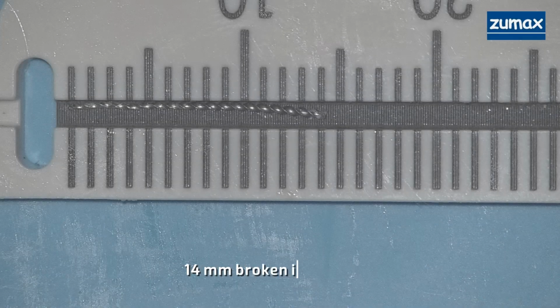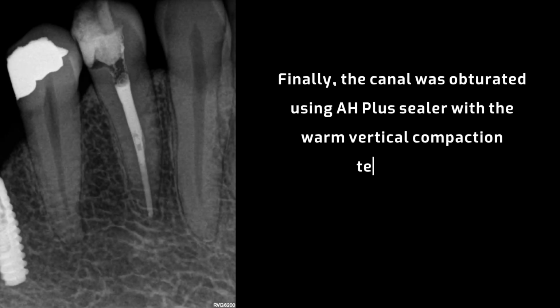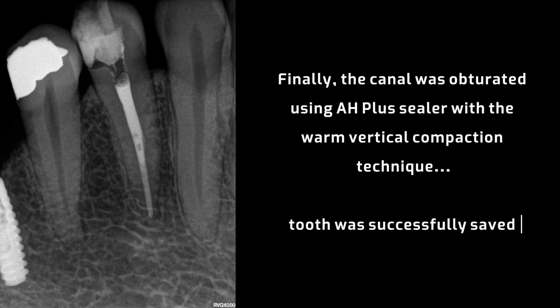(14 mm) broken instrument. Finally, the canal was obturated using AH+ sealer with the warm vertical compaction technique. Tooth was successfully saved.